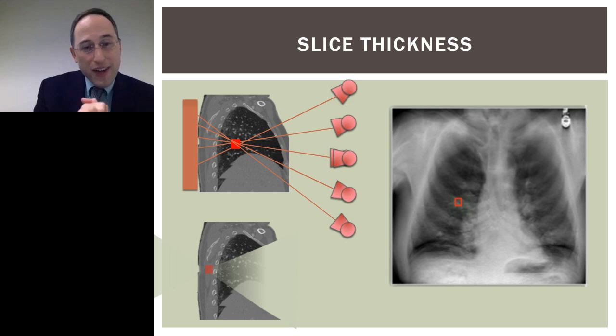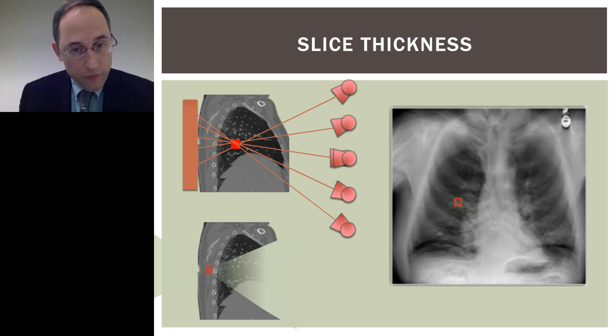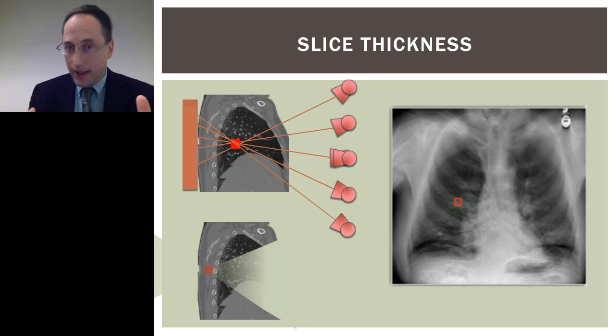There's another very interesting advantage here. Because every tomosynthesis slice is actually created from the superposition of multiple projections, that means to achieve diagnostic signal to noise, you only need, in total, one radiograph worth of dose for an entire tomosynthesis exam. For CT, because CT does not reconstruct in this way, that doesn't work. That is why the CT doses are much higher.